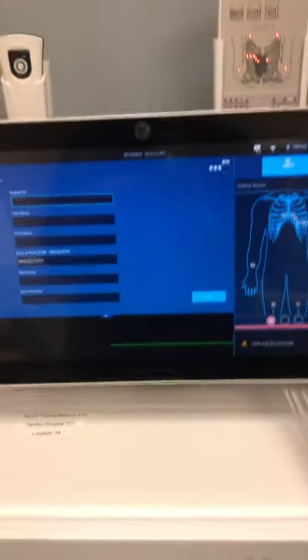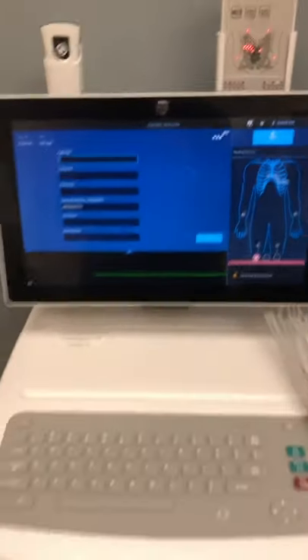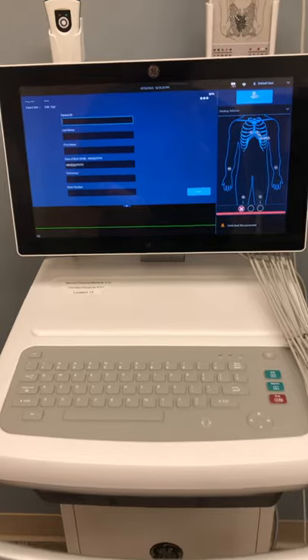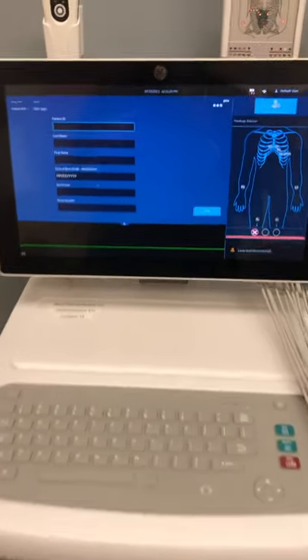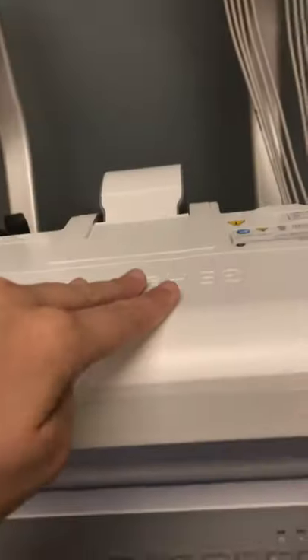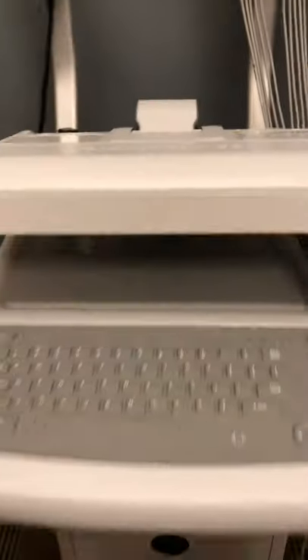Once you're completely done with your EKG, the whole machine can be wiped down with a purple sanitation wipe. Then instead of completely powering it down, grab the top by the middle, pull it down, the light turns off, and now it's in sleep mode.